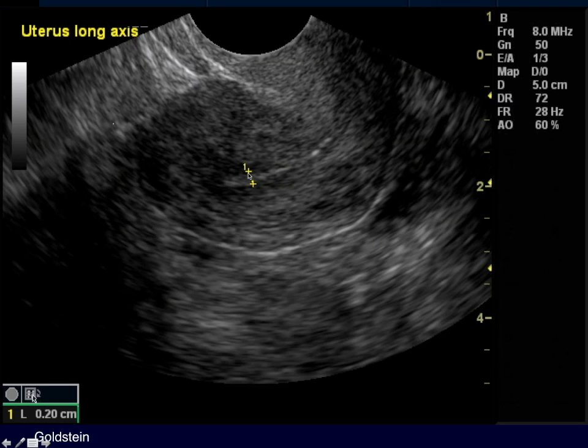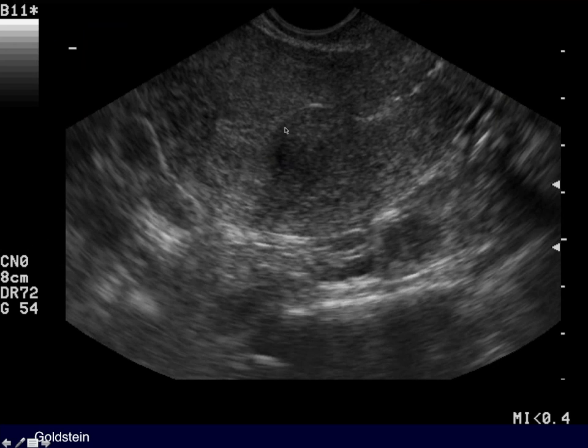Well, here's some examples from that study. Here's a woman on day 4 to 6. She's got a 2 millimeter endometrial echo, and this excludes significant tissue, and her bleeding is dysfunctional and anovulatory. Here's a woman who's got an obvious myoma. You can see some of the endometrium being distorted by it.